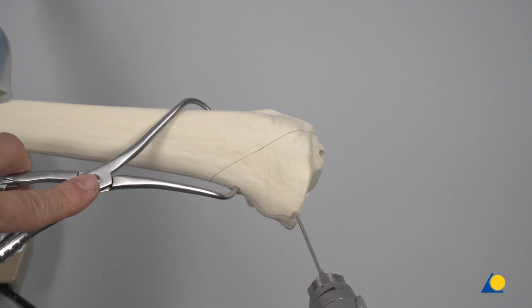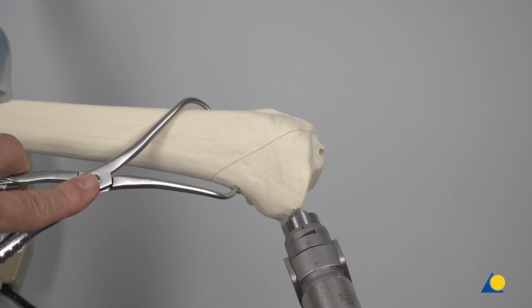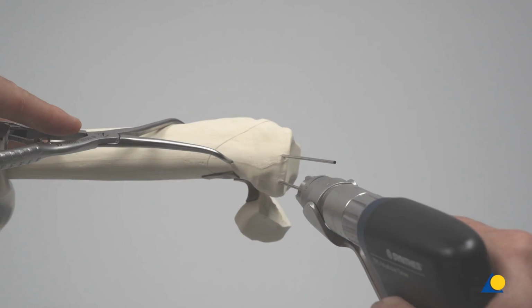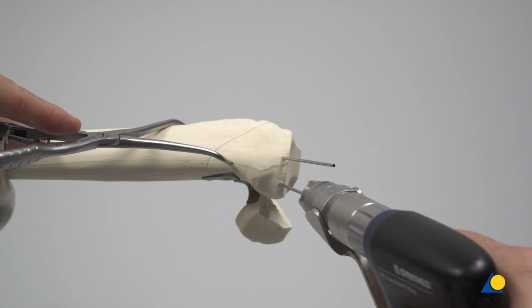The pointed reduction forceps is used to hold the fragment in position. Preliminary fixation is achieved by inserting at least 2 K-wires. Note that the K-wires used for preliminary fixation are inserted close to the joint surface.